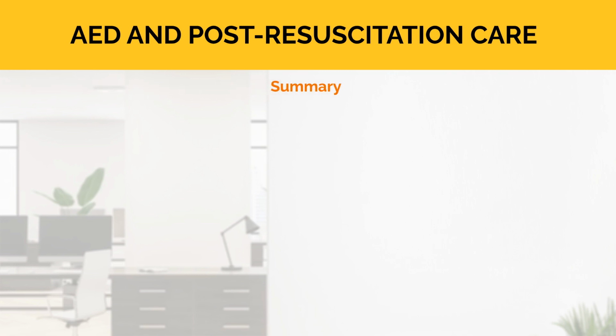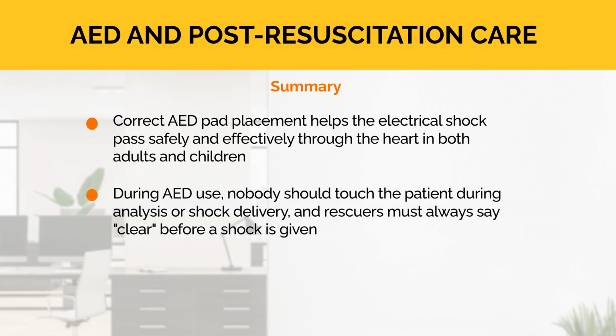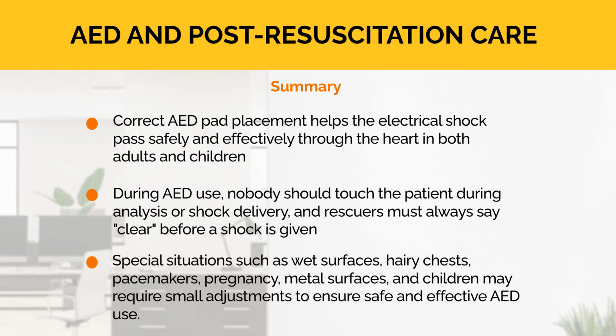In summary, correct AED pad placement helps the electrical shock pass safely and effectively through the heart in both adults and children. Also, during AED use, nobody should touch the patient during analysis or shock delivery, and rescuers must always say "clear" before a shock is given. Special situations such as wet surfaces, hairy chests, pacemakers, pregnancy, metal surfaces, and children may require small adjustments to ensure safe and effective AED use.